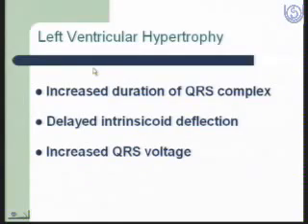Thank you, Dr. Bhargava. You have very nicely explained the basic concepts in ECG. I would like to ask you, because sometimes our DNB candidates may be working in the wards and may be required to perform an ECG on a patient. The technician sometimes is not available. So quickly, can you tell us what are the key points they should keep in mind when they are doing the ECG on a patient? And nowadays, the computerized reports of ECG are coming. So what is the value of that report?